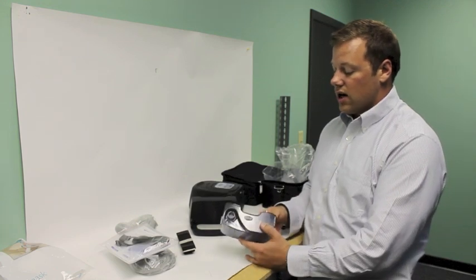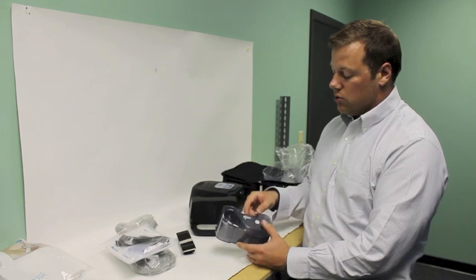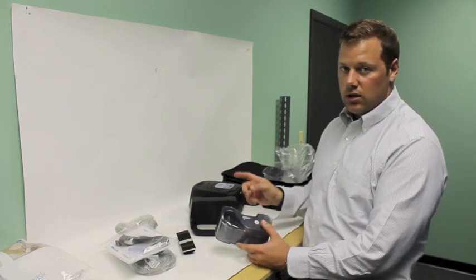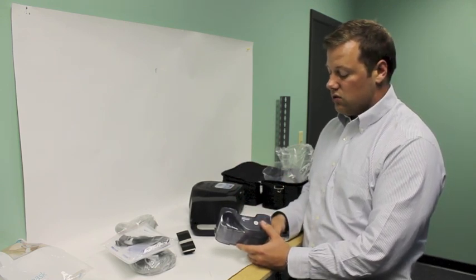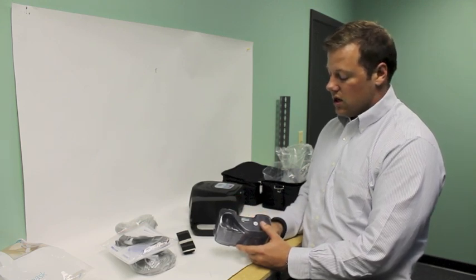If you want to air dry it a little bit better, I would just hook it up to the machine, hook a tube up to it, and then run the blower for about 2 or 3 minutes, and that should get all the moisture out of here so that it dries.